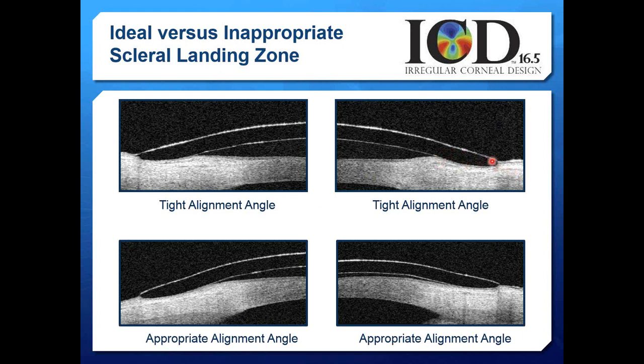It's not pointing along the surface. It's not running parallel to the underlying shape of the eye. It's landing with its nose tipped or pointed in, and that's what creates the blanching. If your edge is pointing along the conjunctival surface, then you generally won't have any blanching whatsoever.